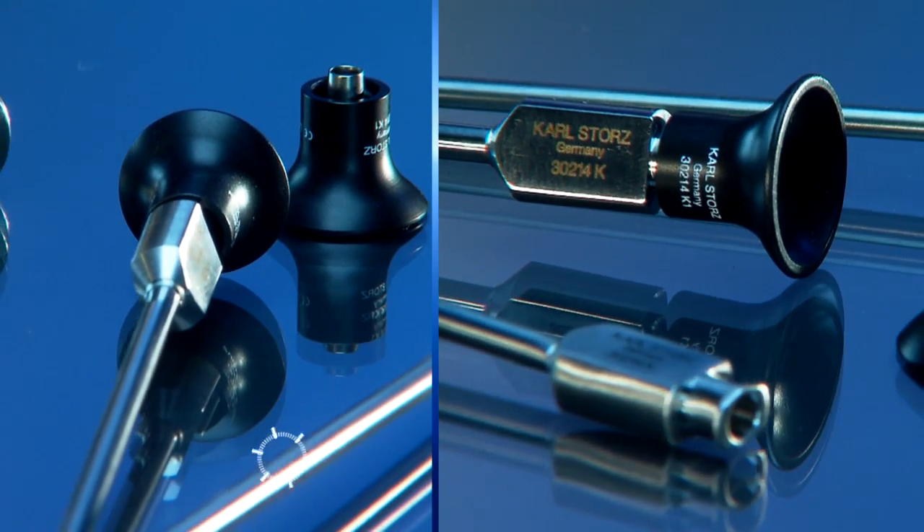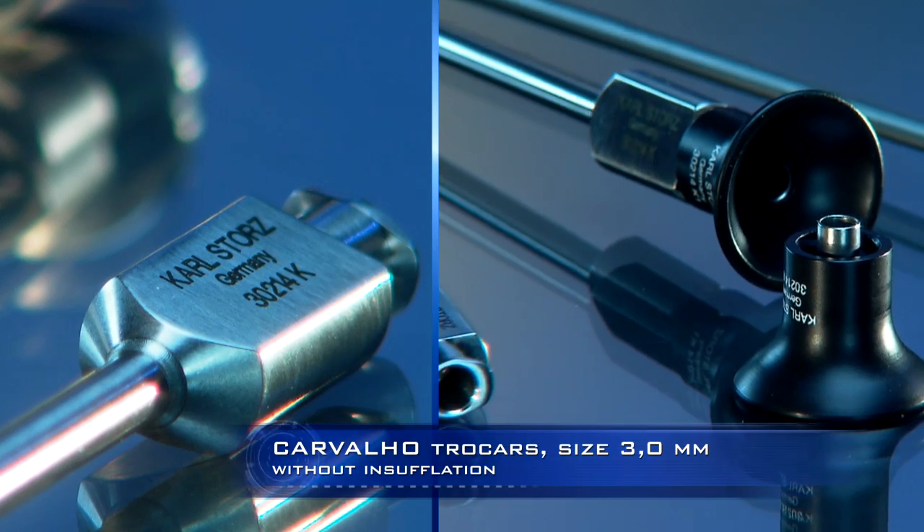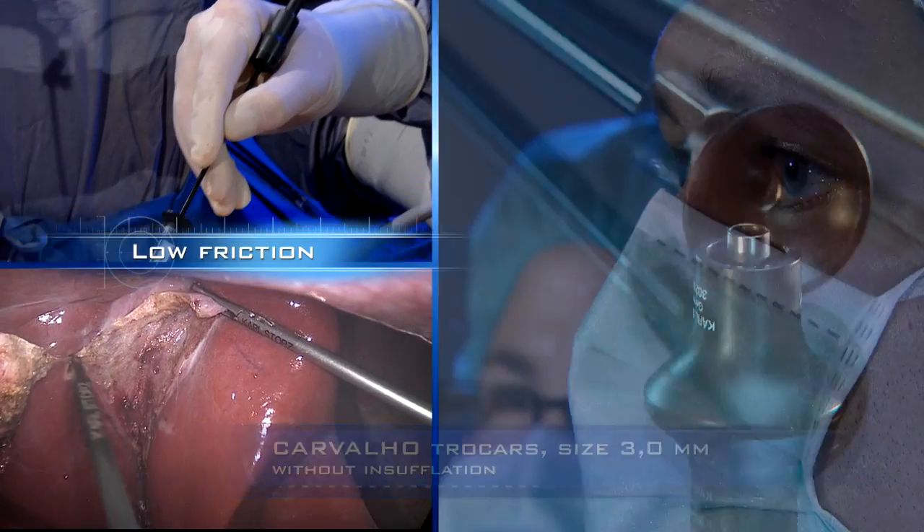The new Carvalho trocars have low friction and are ideal for use in mini-laparoscopy thanks to their slender lightweight design.